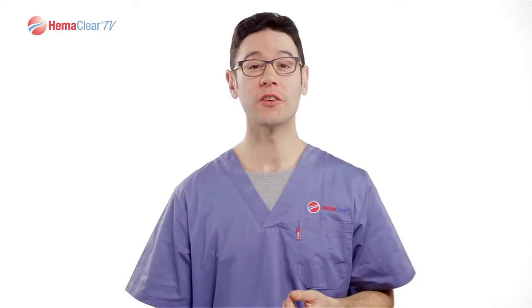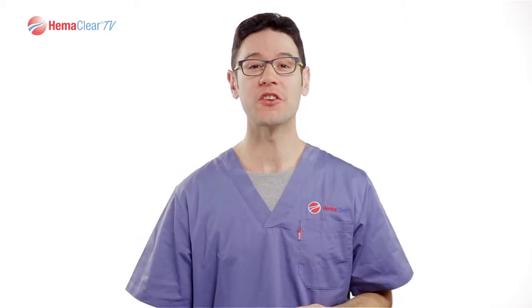Thank you for tuning into the HemaClear Training Center. In this short video, we will discuss the proper application of the HemaClear Model A to the ankle.